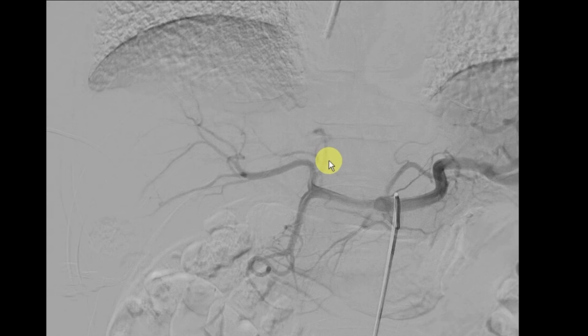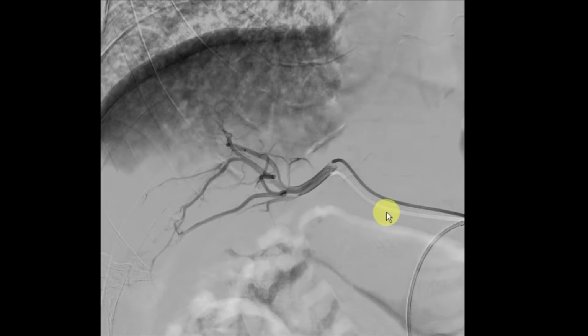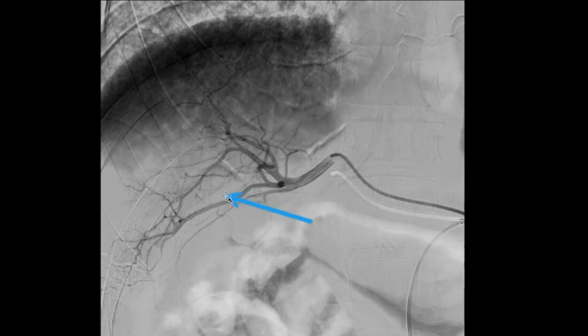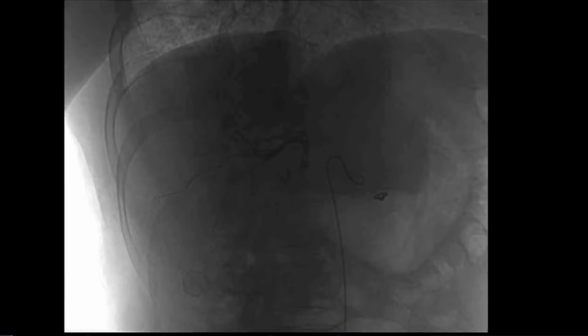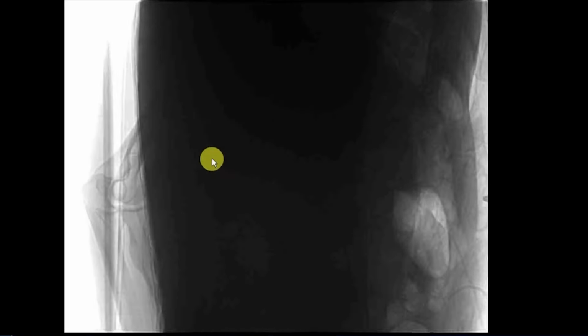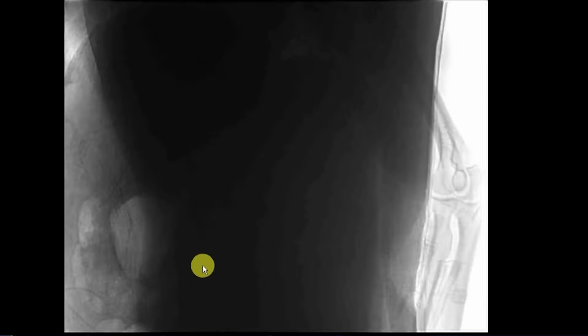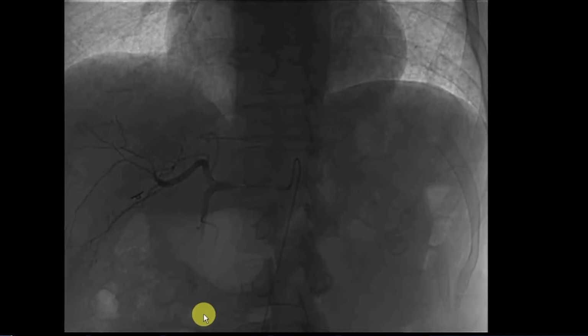So which ones are going to segments 5 and 6 in this case? So here's a catheter that was advanced in the right hepatic artery. We identified that it's the branch going to the segment 6, and this one is the branch going to the segment 5. So we do a spin called a cone beam CT, which we can have a 3D image of the blood vessels, and we can in a workstation have a 3D image of all the liver segments.